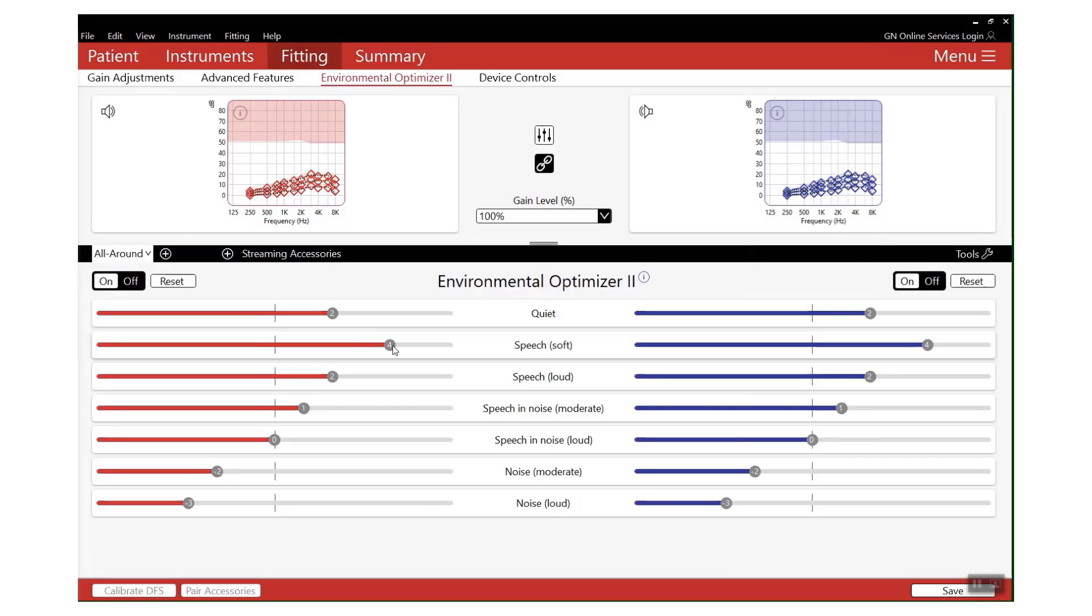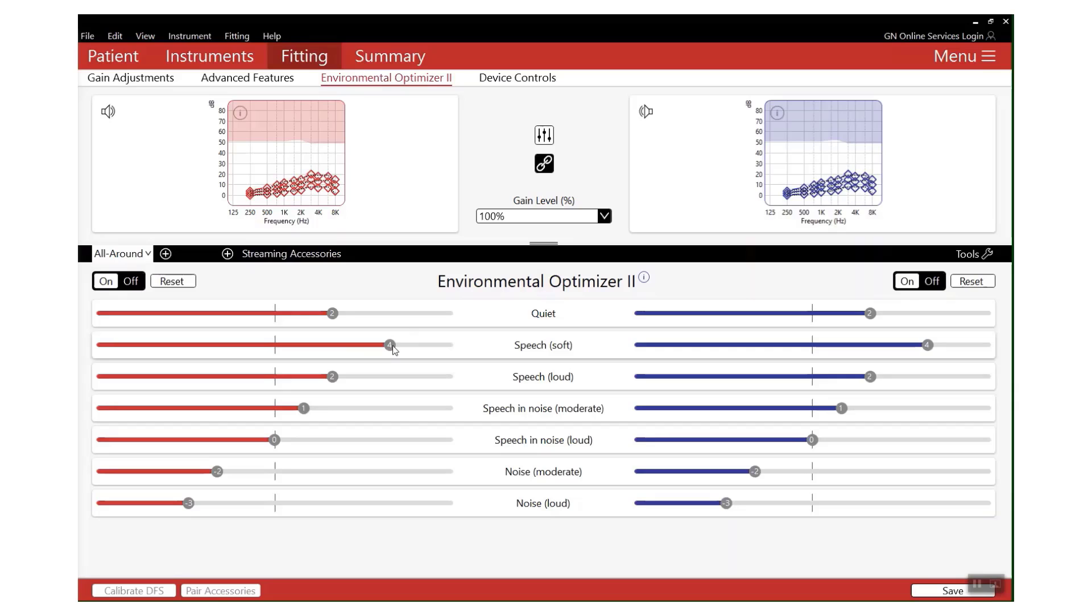Why would you want to do this? Well, sometimes one adjustment to solve one problem can cause another. For example, in this soft speech scenario, if I start increasing the high frequencies or the mid frequencies, I might then create more of an issue with things like the rustling of paper, food packaging, running water, and keys.